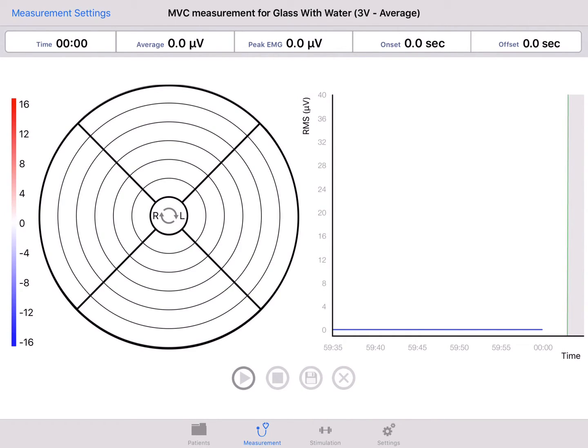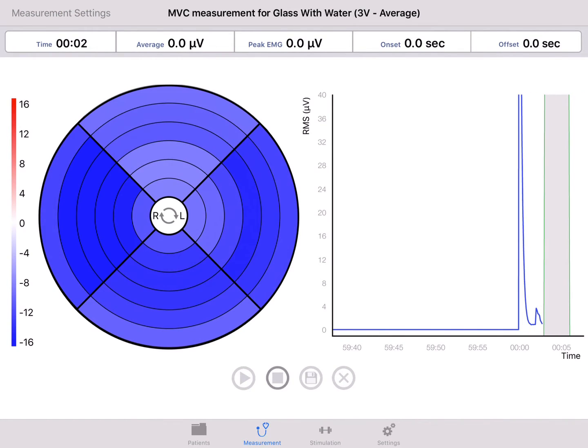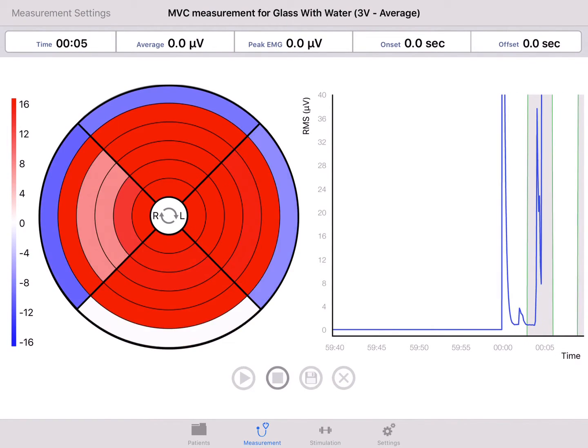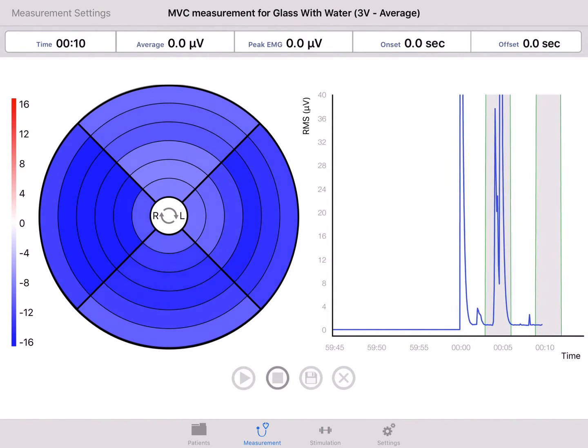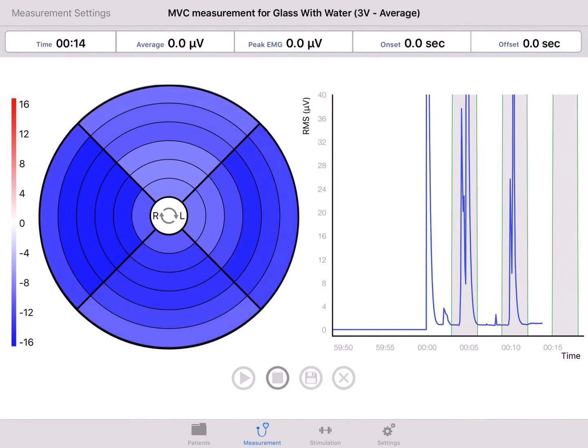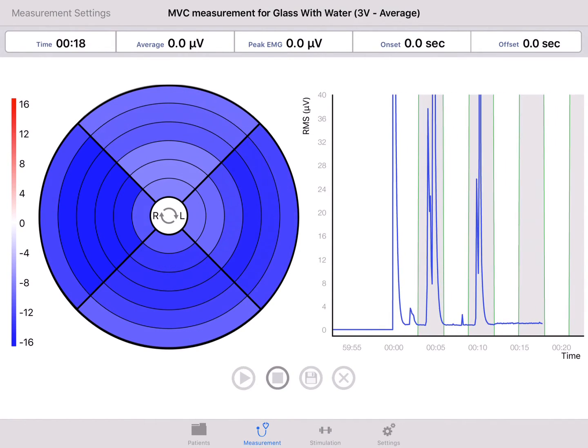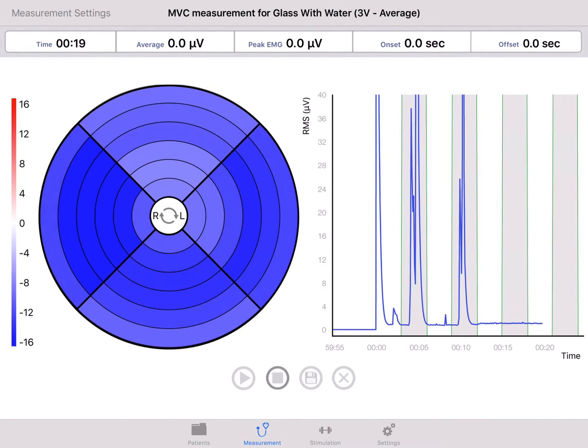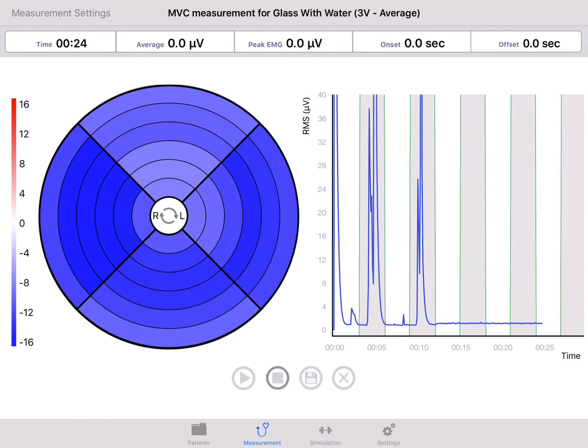Start a measurement now and ask your patients to contract at the grey bars. Please contract. You see the grid in colors now. In this kind of measurement, white means similar EMG activity as the reference group. Blue means less activity and red means more activity than the reference group.